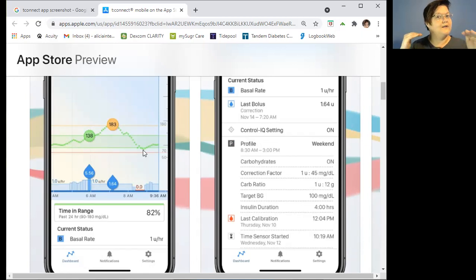I was saying, well, if I don't want it to go so high and take so long to stay up, let me pay a little more attention to my pre-bolus time. Let me pay a little bit more attention to my extended bolus time. Let me do a little optimization with my profile hopping for high-fat foods and things like that. I increased my time in range and my average came down because I took the short-term loss for a really big long-term gain. So those are my recommendations for optimization.